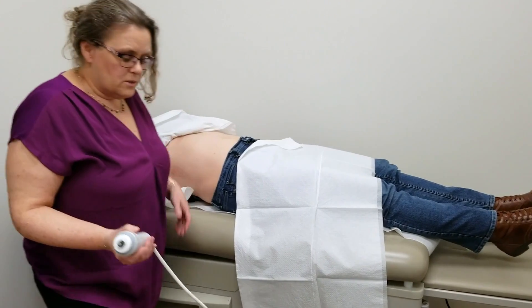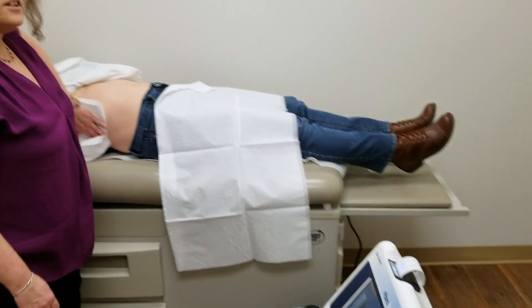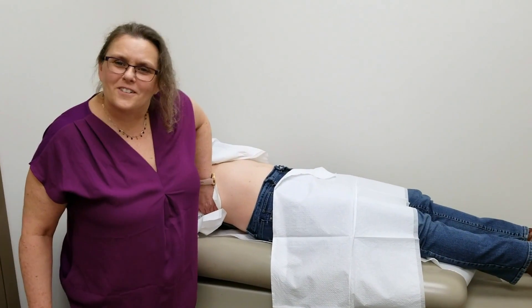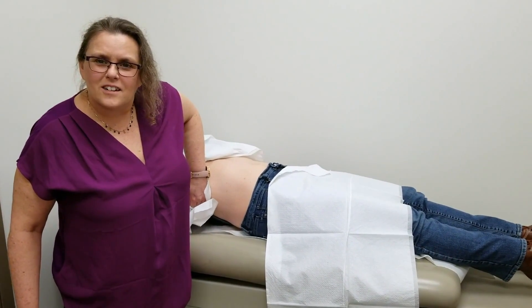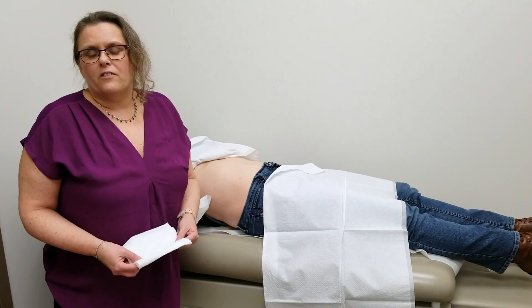And that's all there is — we are done. Let's clean up the patient and the test is over. I hope that alleviates anyone's fears in terms of what to expect if they're having a FibroScan.